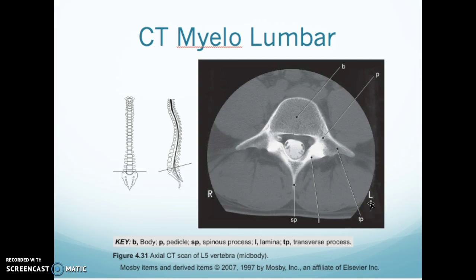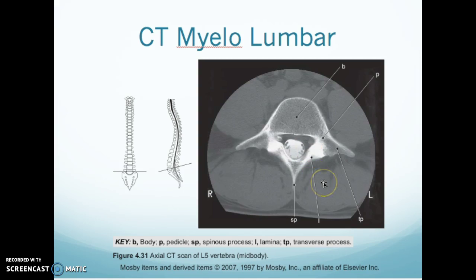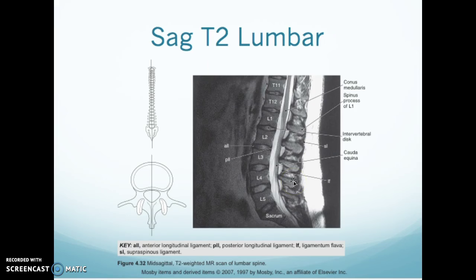This is a CT myelogram — we know that because it looks like an x-ray but has contrast in the CSF, and you know you're down in the lumbar spine as the nerves are just free-floating, not in the cord. This is your cauda equina down low. Here's your body, your pedicle, your transverse process, your lamina, and your spinous process.